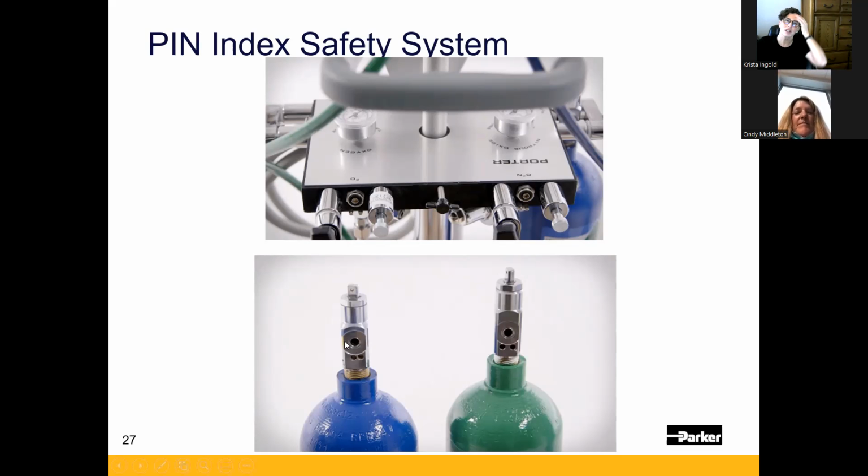The hardest part about this is sometimes what happens is you can see these little ledges underneath here. A lot of times people will think the pins are in the pinholes because they'll feel that catch. And the pins are actually, basically the cylinder is resting on the pins, okay? So if that ever happens, the little swivel bar will not close. So if you can't get that swivel bar to close, you need to take a closer look at your cylinder and make sure the pins are actually in the pinholes and that your washer is actually lined up. More times than not, if you're sitting on those pins instead of in those pins, you'll see actually the cylinder hole right here. You'll see it if you look this way, right away from this platform.